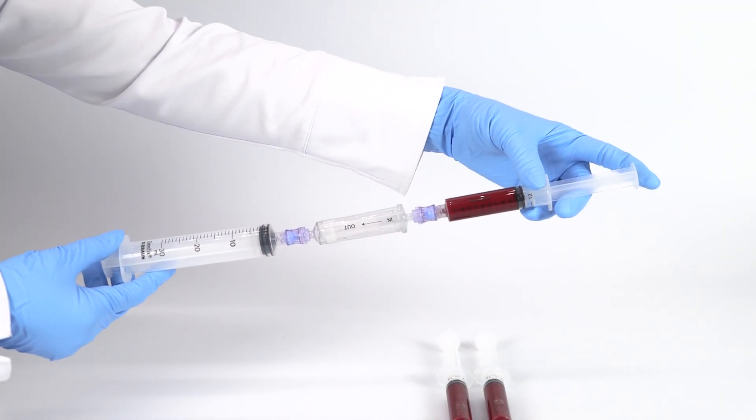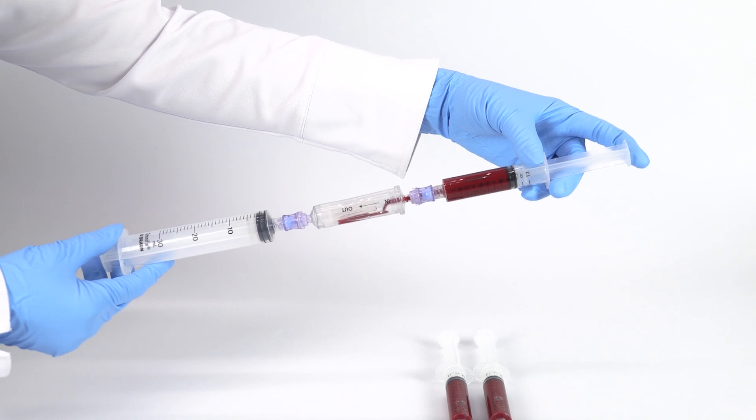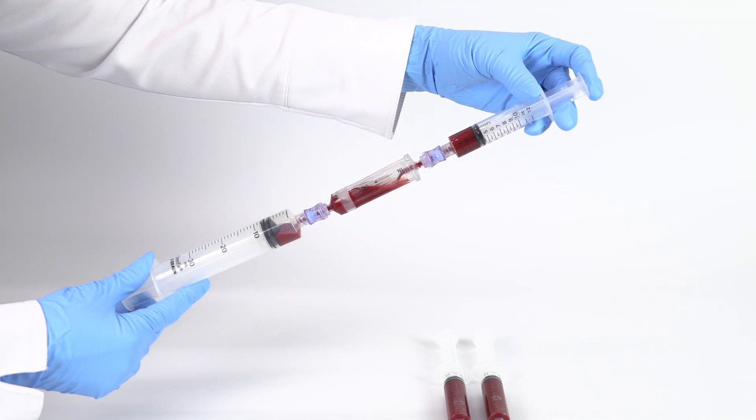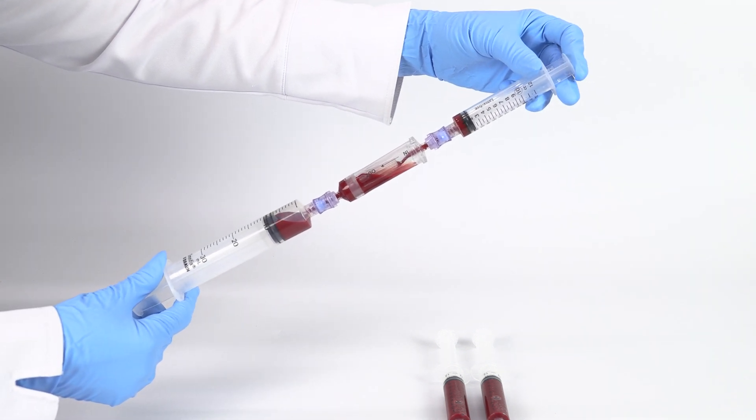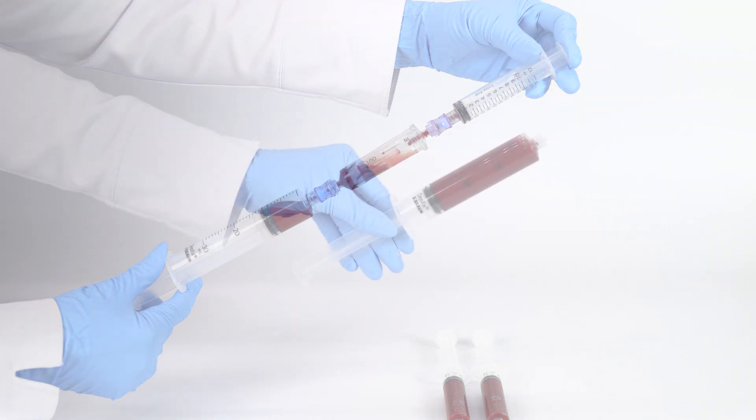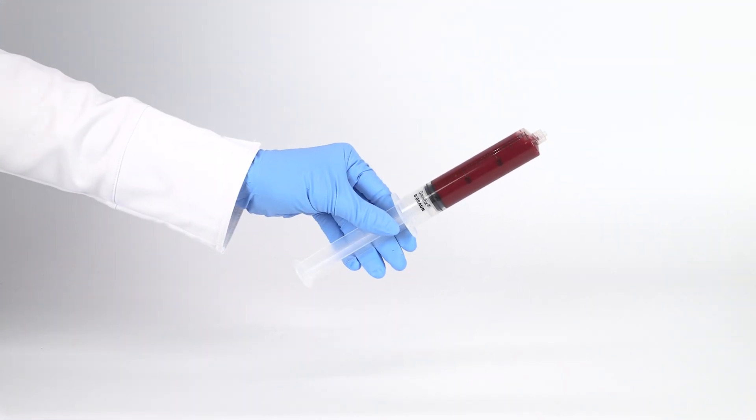Connect each 12-milliliter bone marrow syringe to the in-port of the bone marrow filter. Then connect a 30-milliliter syringe to the out-port of the filter. Filter by injecting the bone marrow from each 12-milliliter syringe through the filter into the 30-milliliter syringe.